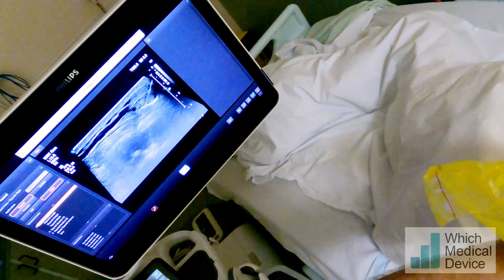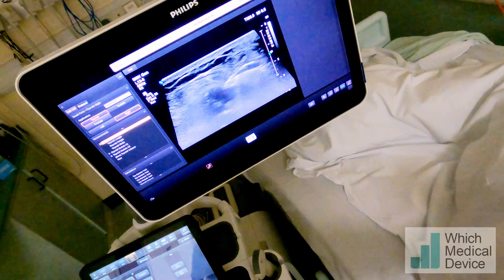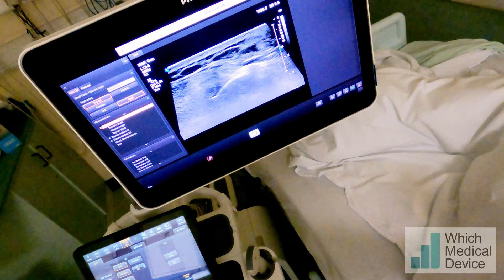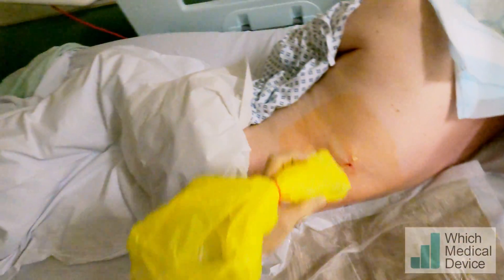You feel some pushing? And we're just going to advance the biopsy — you can see the notch going forward into the tissue. Little click coming up. That's it fired.